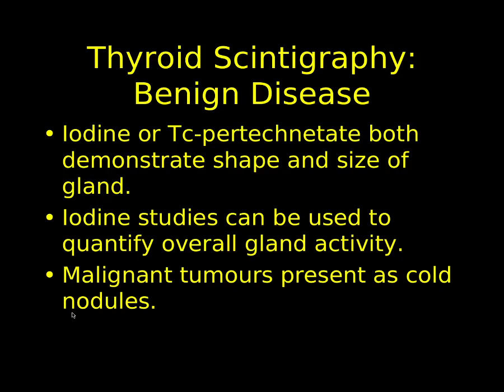However, once you've performed a total thyroidectomy, then the tumour will take up more tracer than adjacent non-thyroid structures such as lung tissue or bone tissue, and when we scan the patient then we will see the tracer uptake of iodine as high compared with the adjacent structures which have no avidity for iodine. So I hope that's clear.